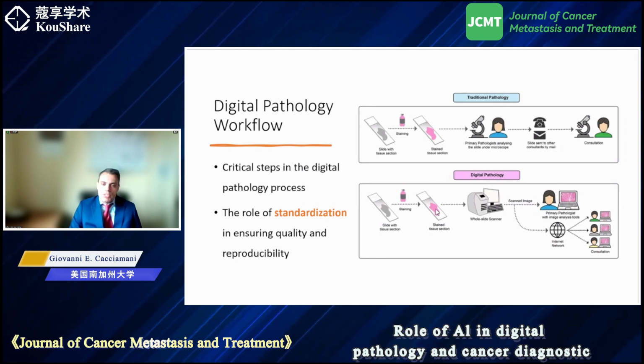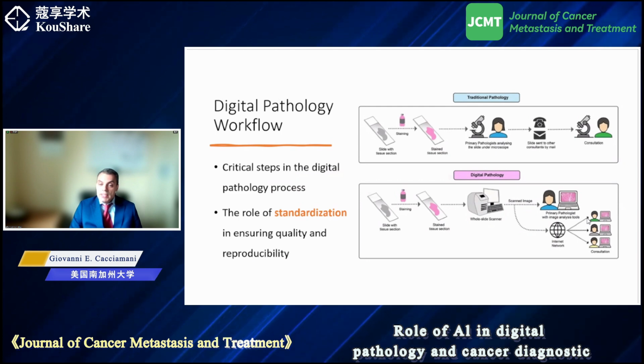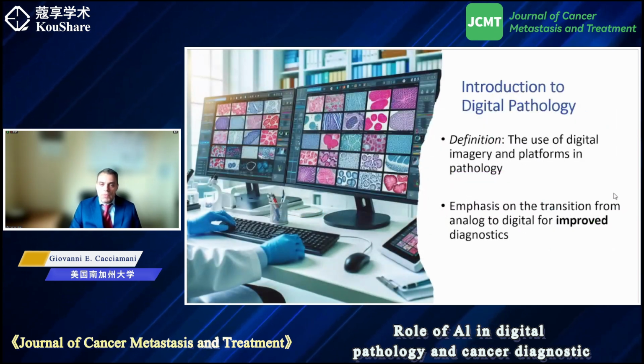In fact, as soon as the slides are ready, they can be digitalized through scanners, and then the pathologist can, on one side, examine the slide not only at the microscope, but also using tools on a screen, and can, very importantly, share in real time, whatever the convenience, the images with other colleagues for easy consultation and case discussion, as commonly happens for clinical things.